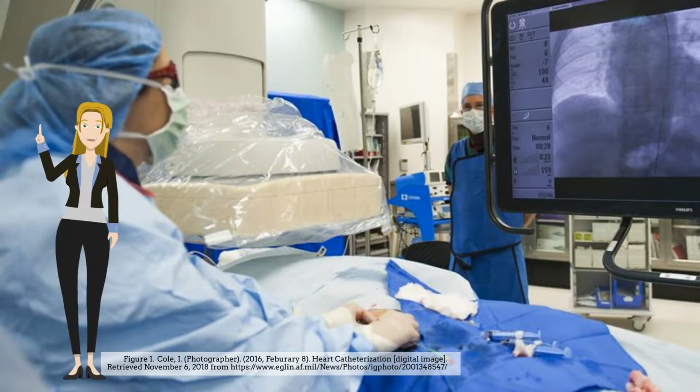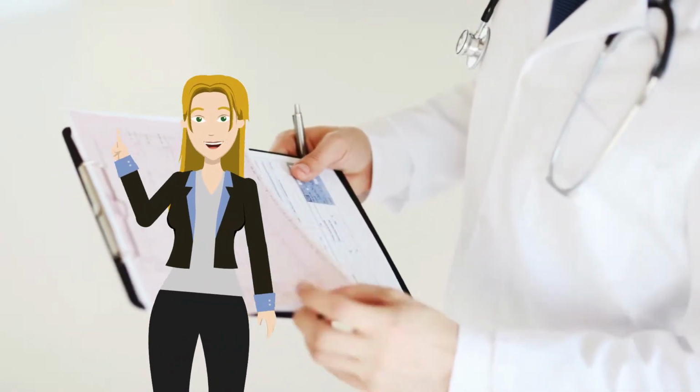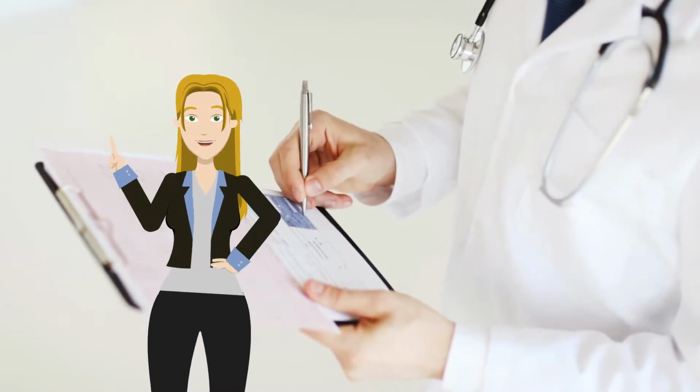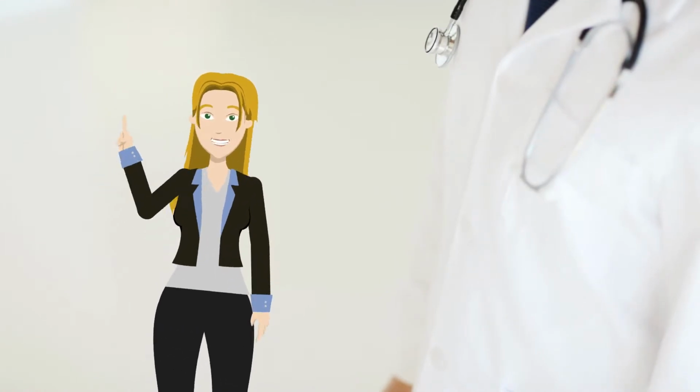Cardiac catheterization is a procedure done to evaluate your heart by inserting a small catheter into a large blood vessel that leads to the heart and using X-ray images to visualize the arteries, heart valves, and chambers. There are three major reasons for your doctor to decide it is medically necessary to perform a cardiac catheterization: an attempt to understand how your heart is working, or why you're having chest pain, for example.